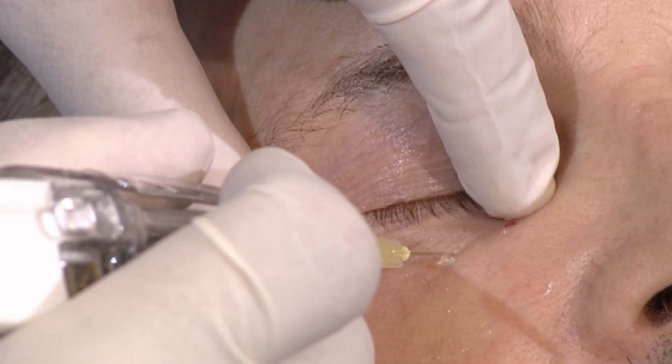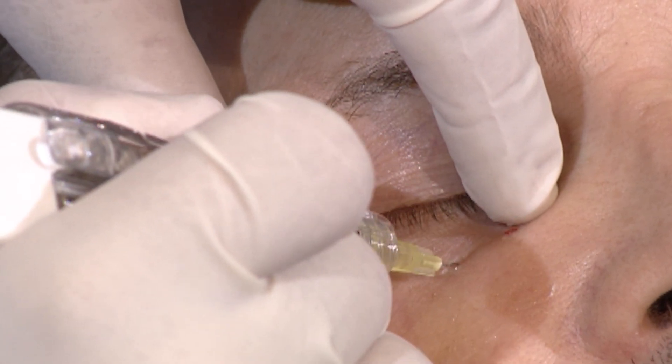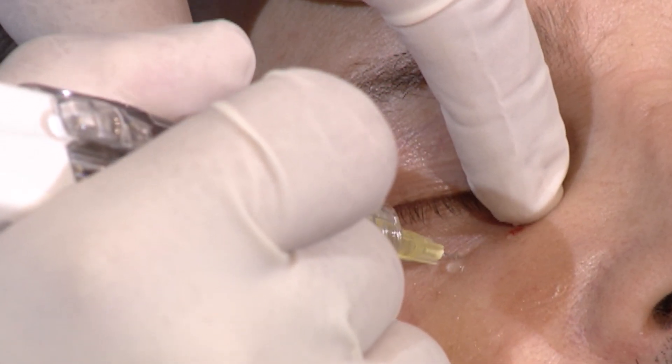And you feel the bone. For this internal point, the midpoint, the same — then you feel the bone. Three little bolus.